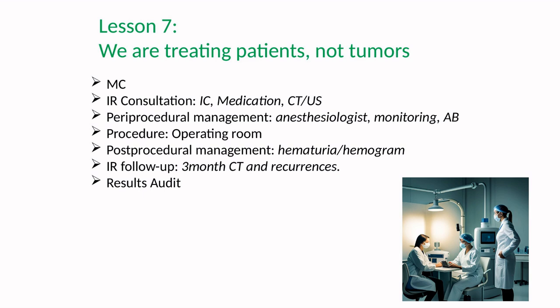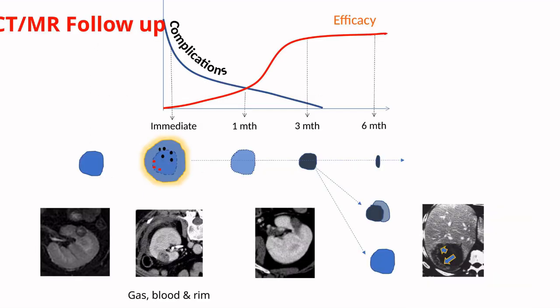Manage conscious sedation or, much better, have an anesthesiologist. Consider antibiotic prophylaxis. Be prepared to handle complications. During follow-up, remember that the first CT or MRI is performed to rule out complications. You need at least 3 months to assess the efficacy of your ablation.